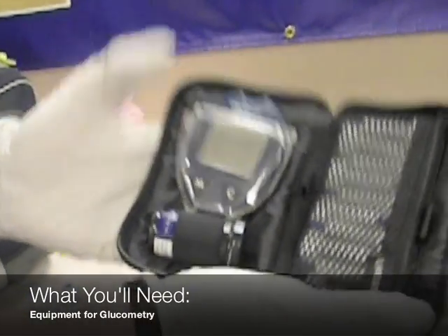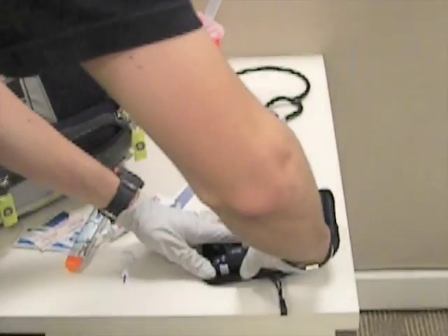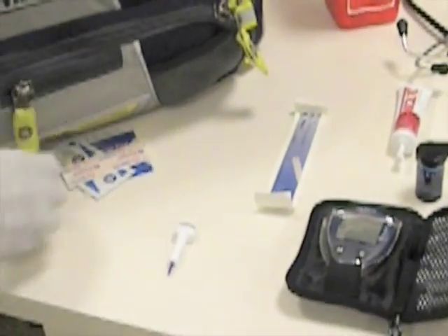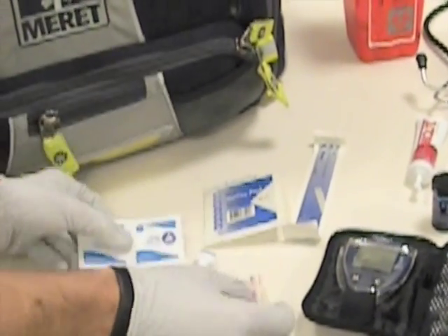Our glucometer, lancets, test strips, glucose, tongue depressor, gauze pad, alcohol preps, and band-aids.